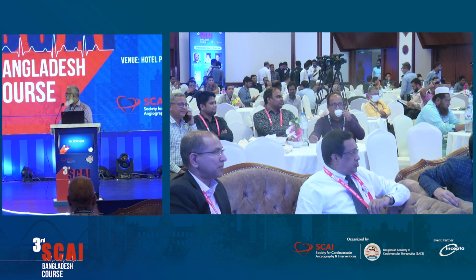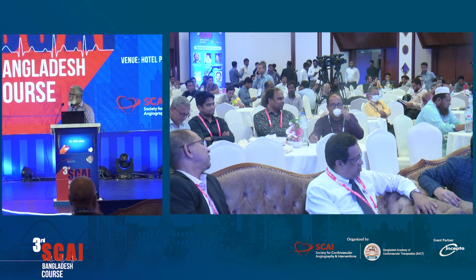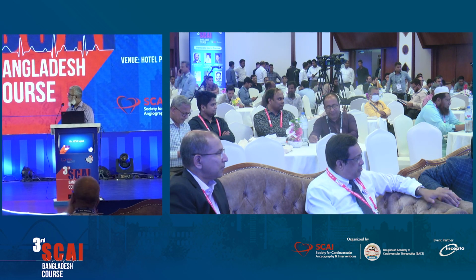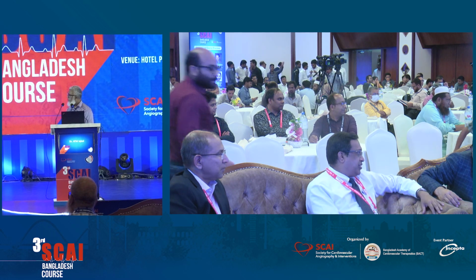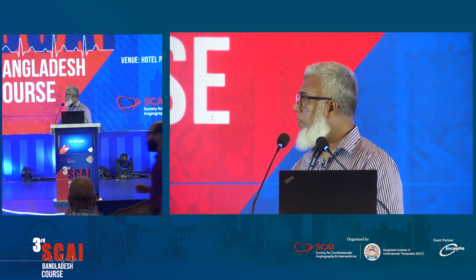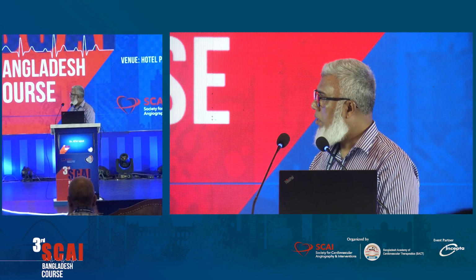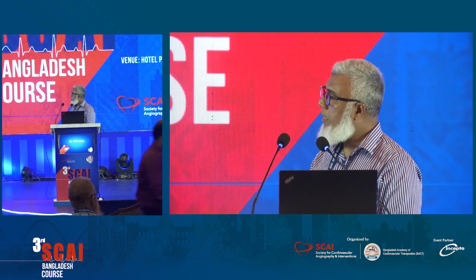Thank you for your brilliant case. As you decided upfront on a double stent strategy, and the angle is small and narrow, that is why you chose mini crush. You have done excellently. But falling into this problem, losing the wire and stent from the LAD and once again re-entering, is a very difficult job which you have overcome very nicely.